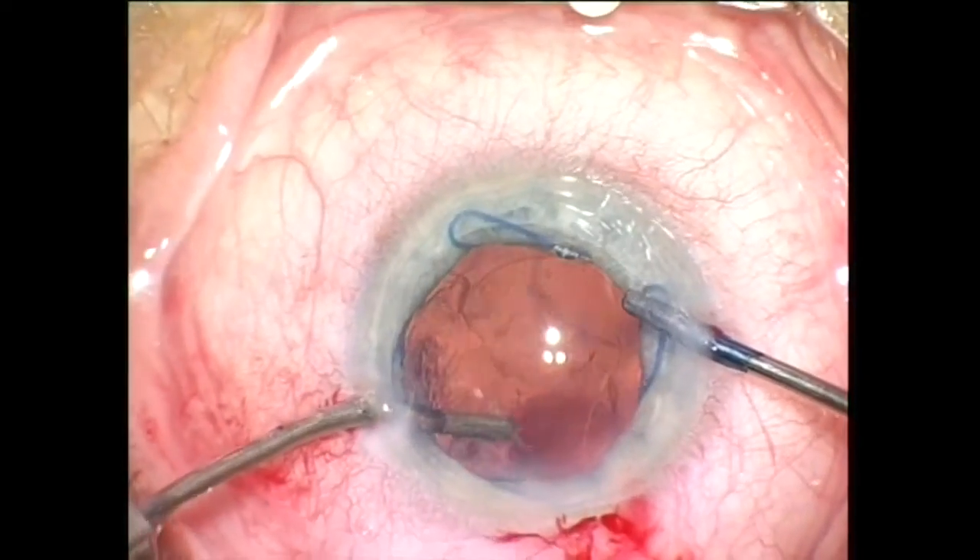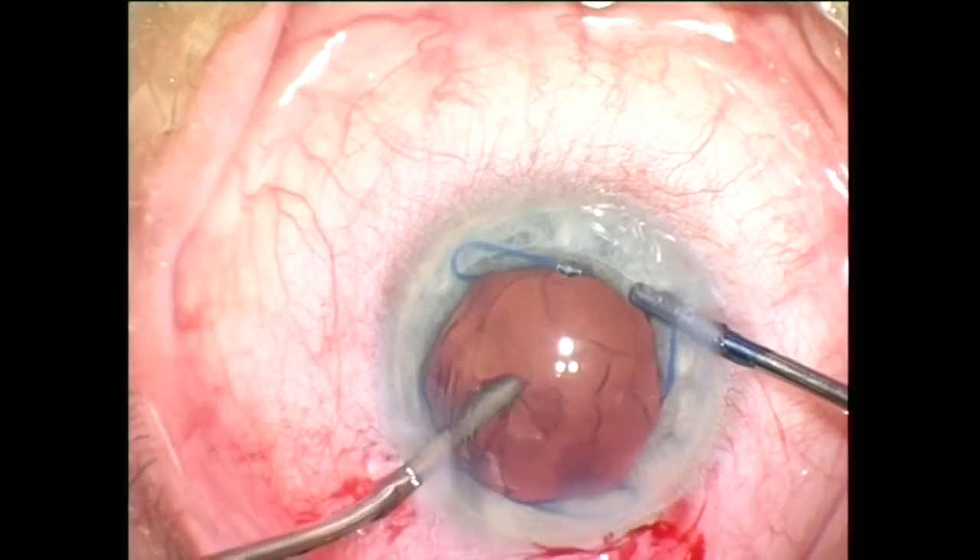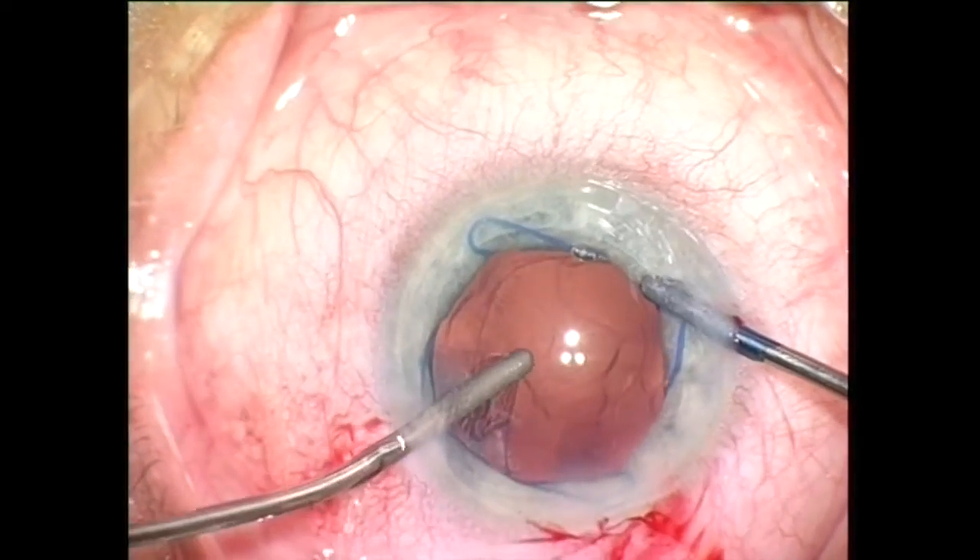Bimanual irrigation-aspiration allows me to reach cortical material in every segment of the capsular bag.